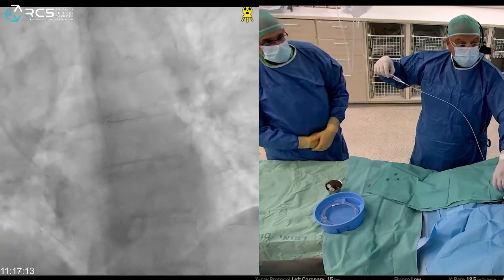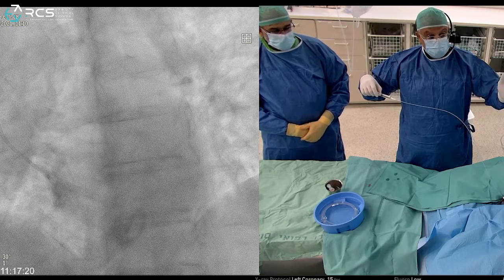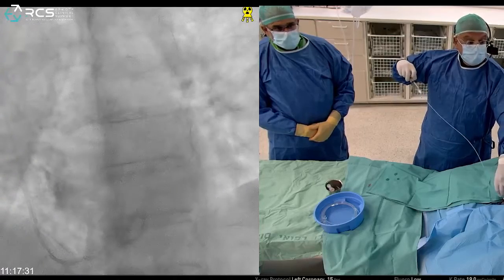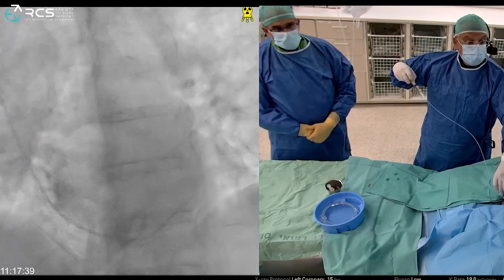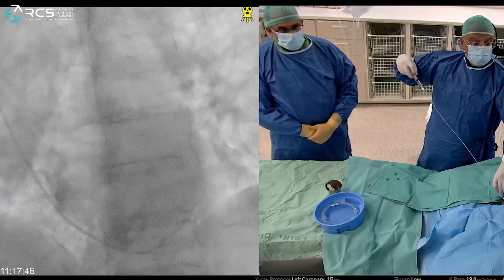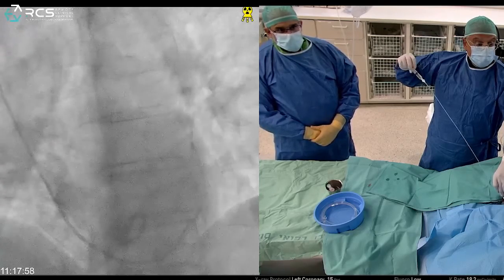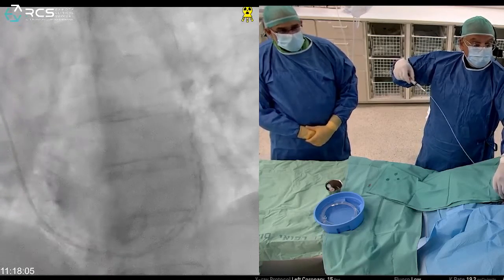At 30 degrees LAO, I go with the catheter from 11 o'clock on the screen to 5 o'clock, giving little tests trying to cross the tricuspid valve. If I see a lot of VPCs it means I'm in the right ventricle. Here is the coronary sinus — I go only with the catheter without a wire. I rotate my syringe and gently go deep into the coronary sinus, avoiding small branches. If the tip goes into a small branch, I change angulation. If it doesn't advance, I can use a wire.